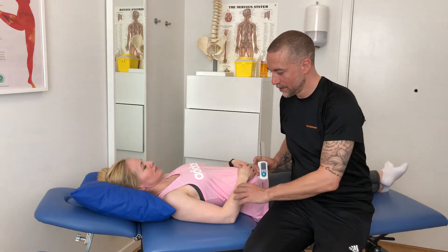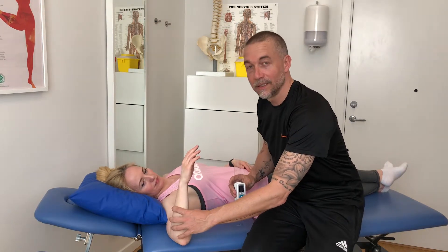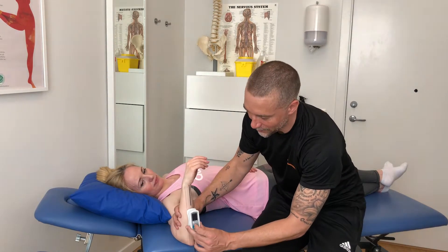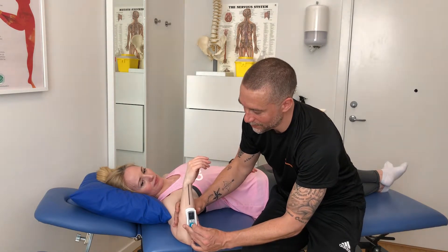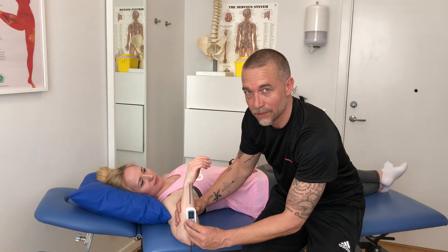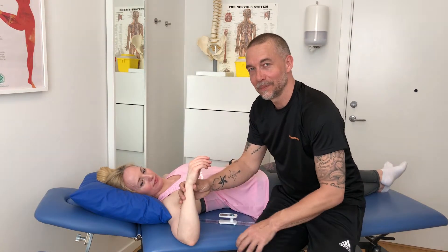Take the shoulder into 90 degrees of abduction. I have my device here and I align it with the olecranon. Then I press the button again to start the measurement.